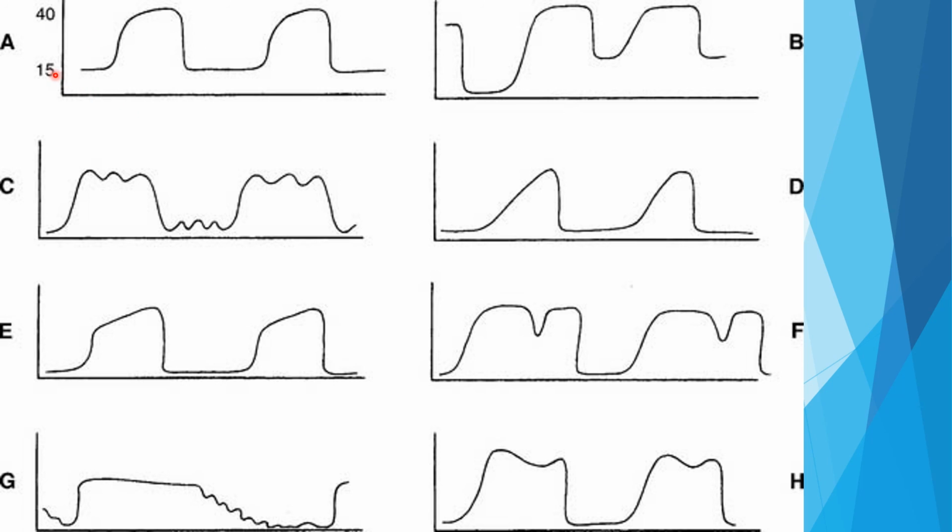So this is a CO2 curve. We see it's about 15 every breath at starting, where inhalation should be 0 because you're not breathing in it, or it shouldn't be starting until you get up here. So it should be down here at 0. What's going on here is a mechanically ventilated patient with a malfunctioning expiratory valve.